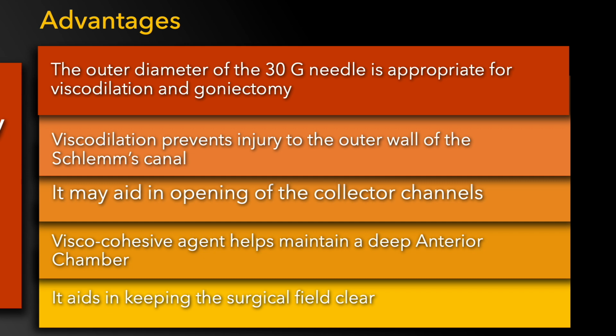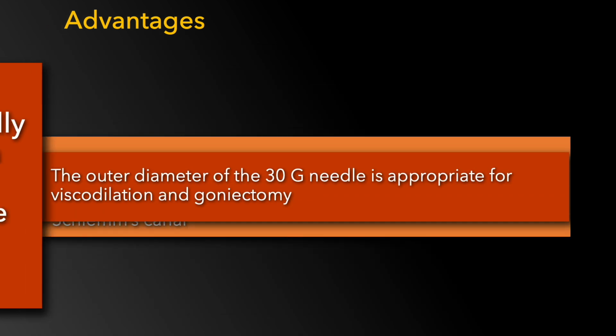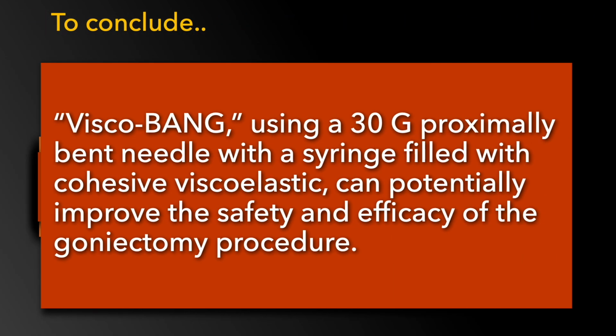To conclude, Visco-BANG using a 30 gauge proximally bent needle with a syringe filled with cohesive viscoelastic can potentially improve the safety and efficacy of the goniectomy procedure.